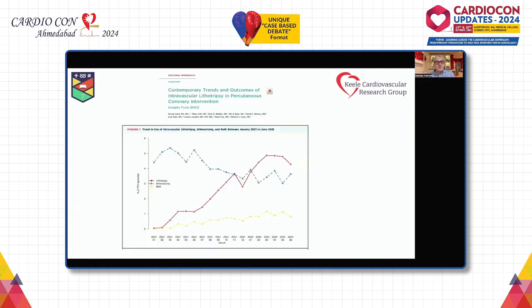In the United States, again, we're seeing very similar findings, in that lithotripsy tends to have overtaken either orbital atherectomy or rotational atherectomy, as you can see in this figure. But the important thing to say is a significant proportion of cases use both types of techniques. And so I don't think it's helpful in these discussions to say, I would only use orbital atherectomy, or I would only use rotablation, or I would only use IVL. The chances are that you may need a combination of these, either RA or OA with IVL, in many of the cases that we do.